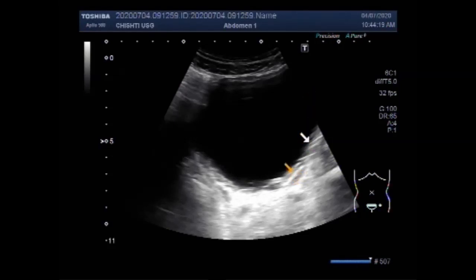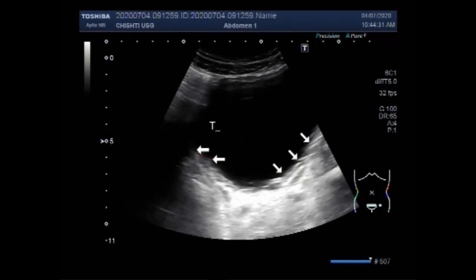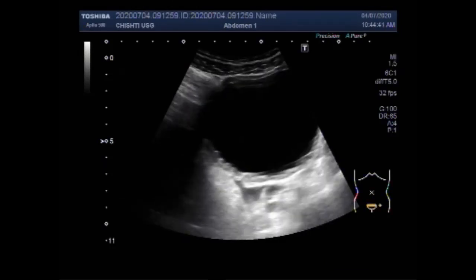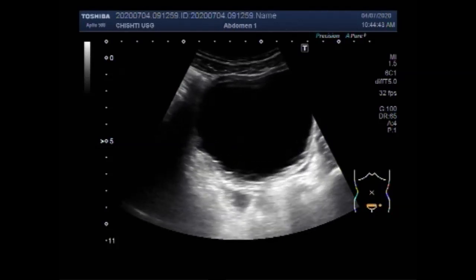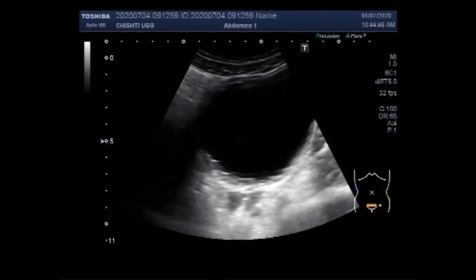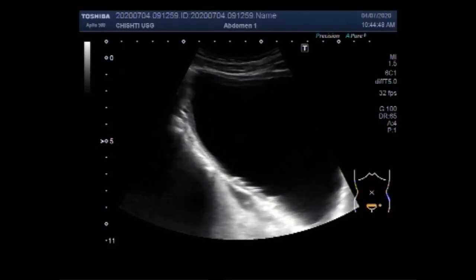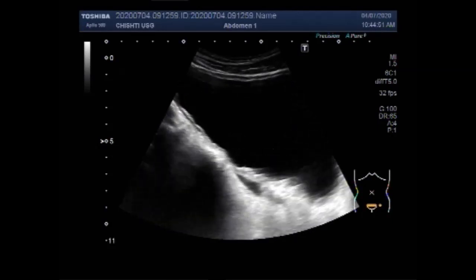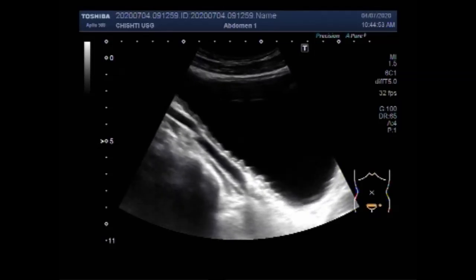You can see these are the small trabeculi. The normal bladder wall has a mean thickness of 2.76 mm when the bladder is almost empty, and 1.55 mm when it is distended. There is a linear relationship between bladder fullness and bladder wall thickness. The upper limits are 3 and 5 mm for a full or empty bladder respectively.